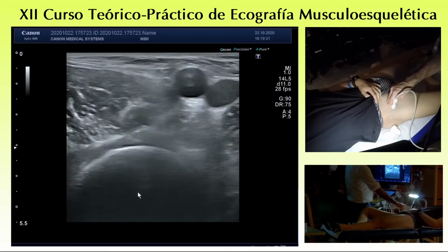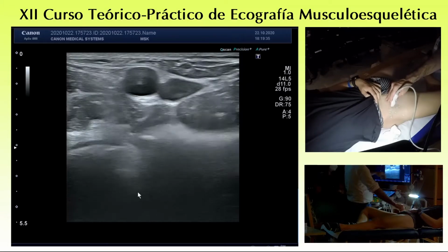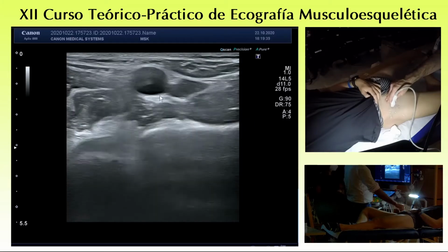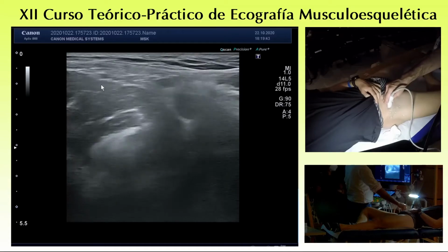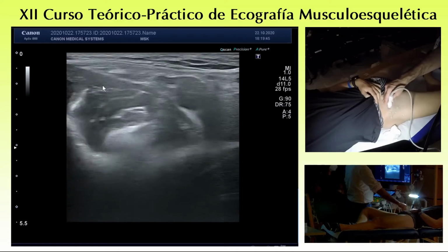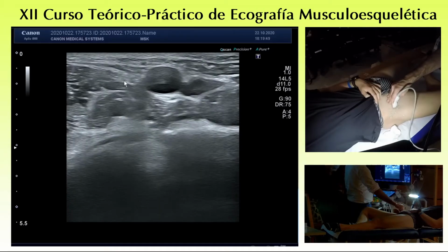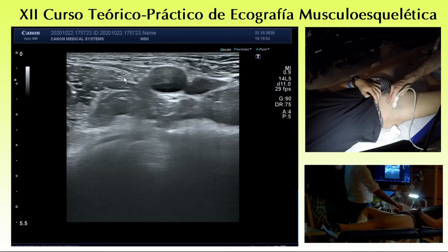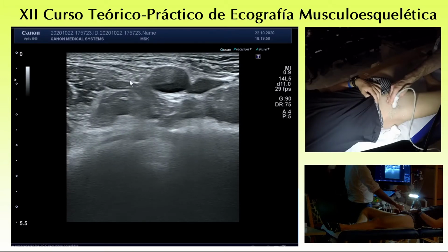Okay, so moving further medially, we have the neurovascular bundle, and this is a very good image to see it. If I move proximal it is a bit more difficult. Here is the best. Okay, you see very well the femoral nerve, just distal to the inguinal ligament.